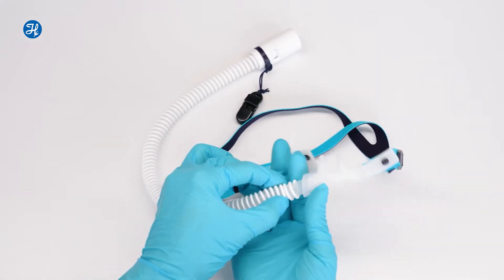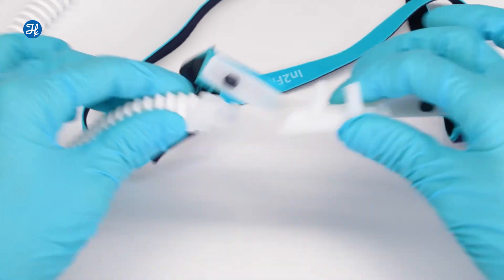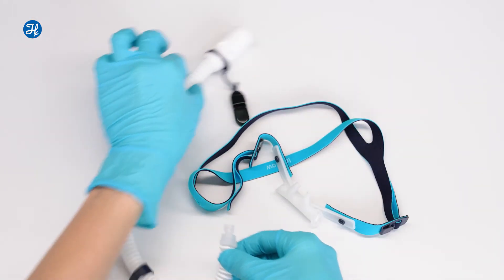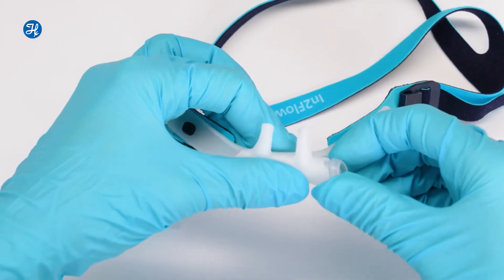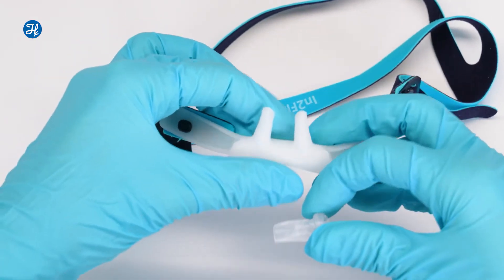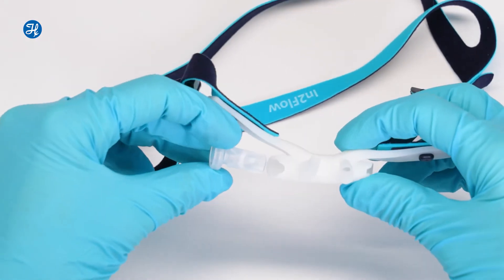Now push back the locking ring on the side with the delivery tube, and then remove it. Then remove the sealing plug from the side without the delivery tube.